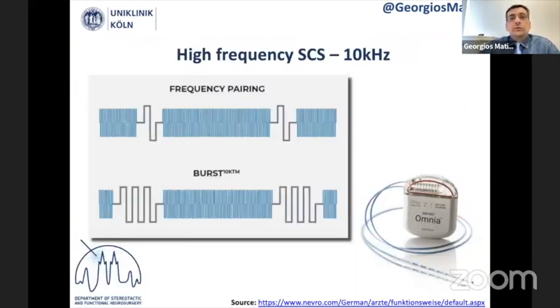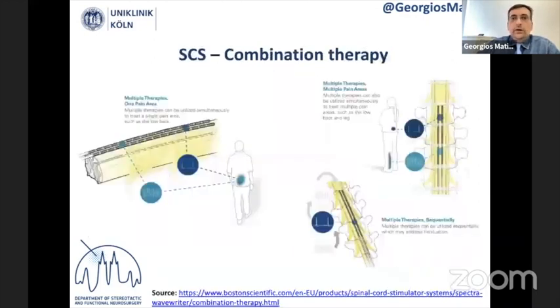We have the possibility of frequency pairing, meaning that we can apply a tonic stimulation and then high frequency, then again tonic stimulation and so on, or burst and high frequency and once again burst, not at the same time, but sequentially. We have also the real combination therapy.